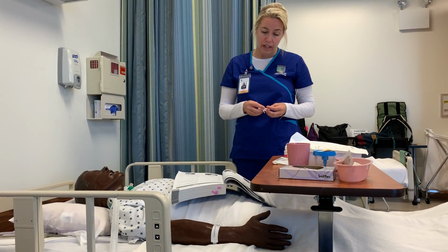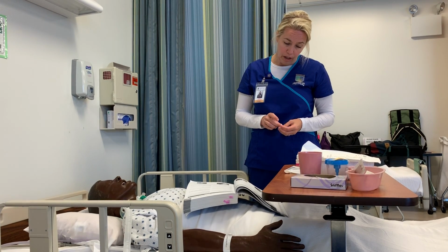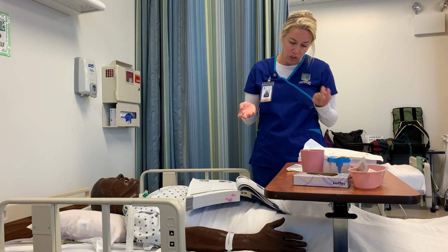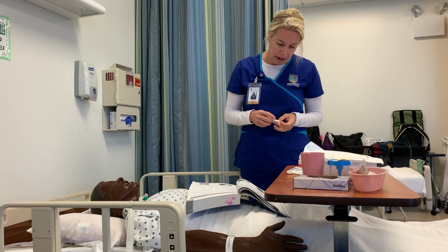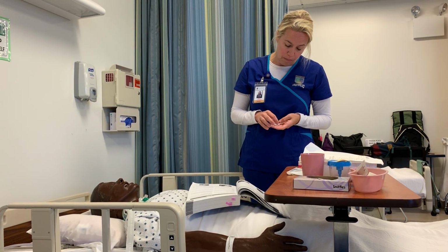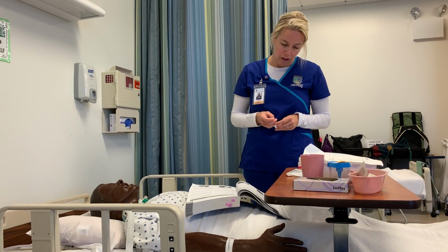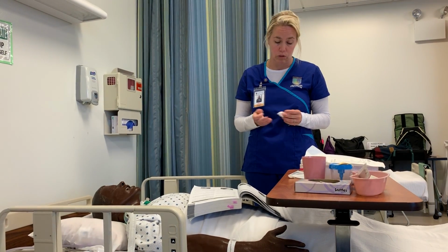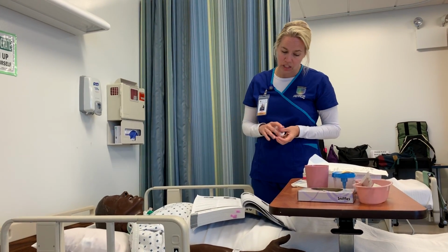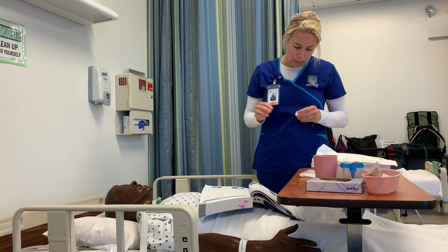All right, so now with the use of an inhaler, again, I would identify the patient and make sure that their name and date of birth and all that compares to the MAR or the medical record. And I would compare the medications and the labels and make sure that all adds up or works together. And then I would make sure that the patient is in a comfortable environment, sitting or at a table.